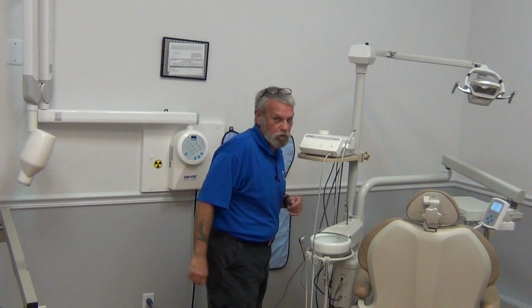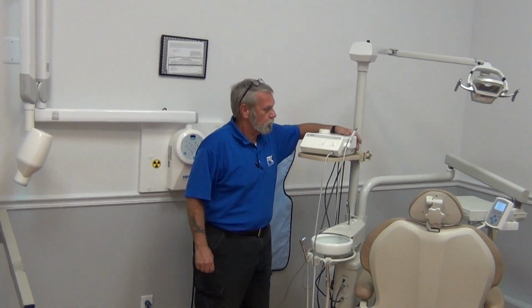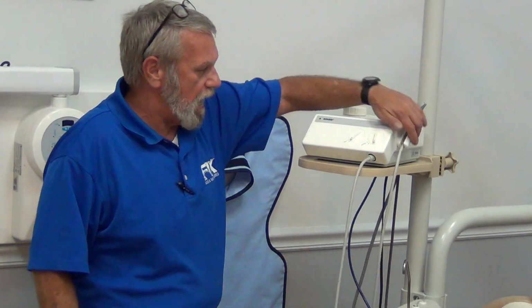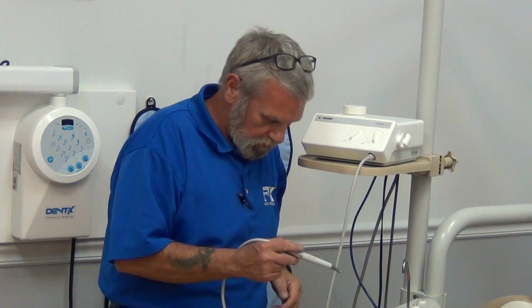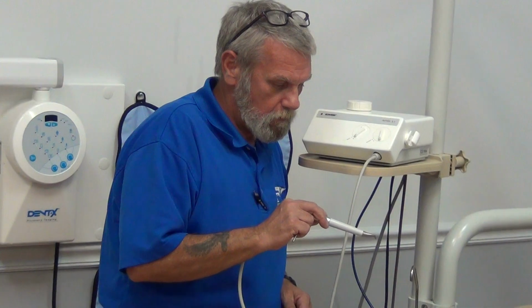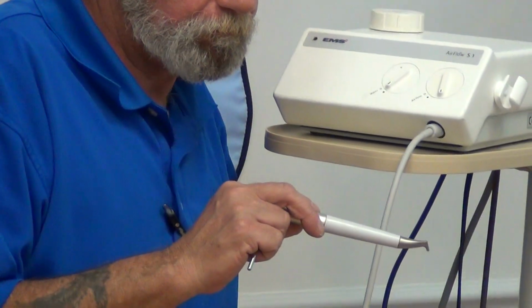Now let's check and see if the Prophy jet's going to come on. Master switch on the back. By George, I just heard something. That's it exhausting the powder out. We're on and we pressurize with air. First problem is, I don't have any water. I can't get enough water out of this unit. So you're going to try the water, and we don't have any water. The water is just fizzling out.